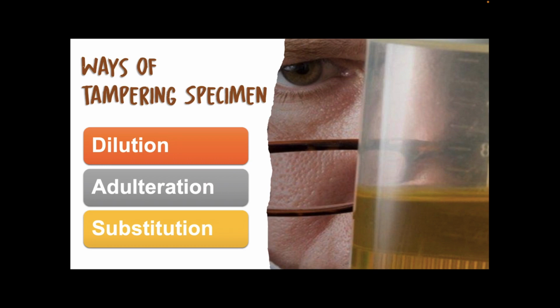So when we say a specimen is diluted, that means a specimen has been modified by adding water or other solvents to it in order to lessen the concentration of a particular analyte in a sample. So in this case, we are talking about illicit drugs. If the urine is diluted with water, then the concentration of those drugs will be decreased. So there is a tendency that a false negative reaction will be obtained.